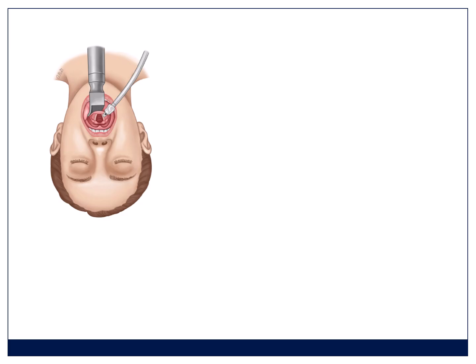So now we come to laryngoscopy, and this is contained in some of the other videos. Remember that you're starting with a curved blade. It's more forgiving of imperfect placement than a Miller blade, and you want stepwise progression when you intubate. So the first step is you insert the blade. You insert that without doing dental damage, so you're looking at the teeth, and you tongue sweep to the left, and you advance the blade.